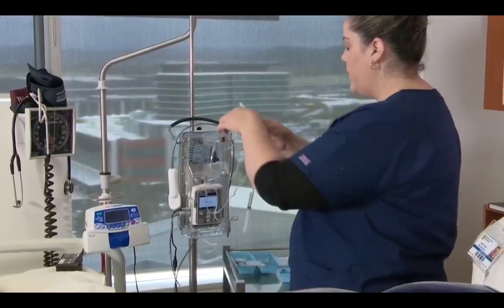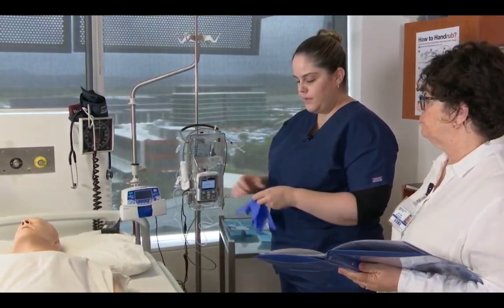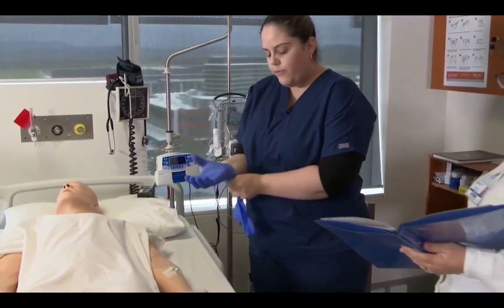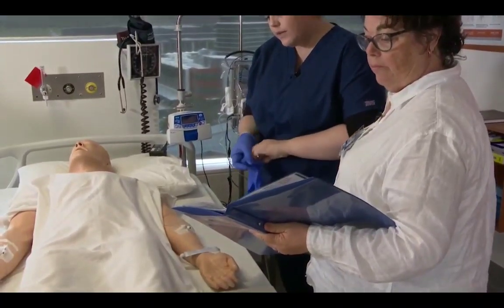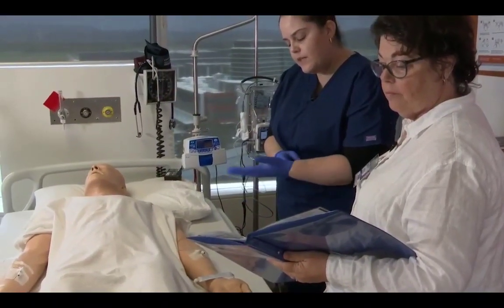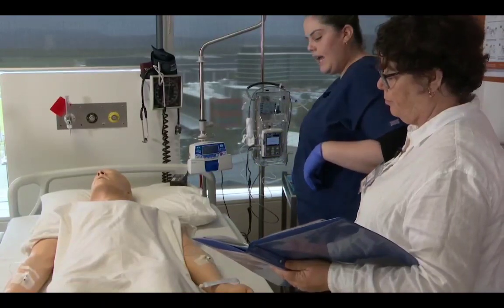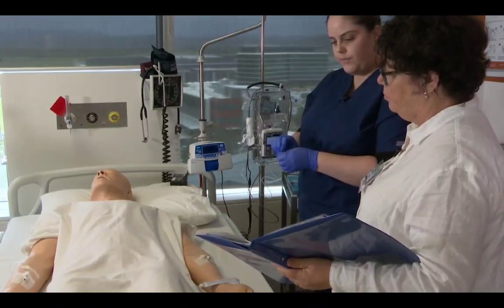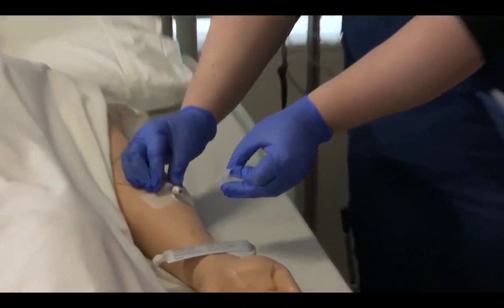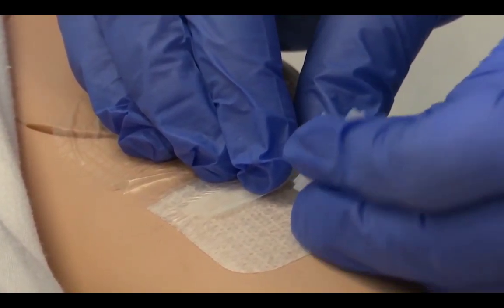So I'm going to place that just there for the moment. I'm going to put on my gloves. John, can I just get you to confirm one more time your full name and your date of birth for me? This is John Bryant, the 13th of the 3rd, 48. Yep, that's perfect. MRN is 2017-05. And confirming that you don't have any allergies that you're aware of. You do not. Okay. So taking my Alco swab, coming to my cannula, swabbing that for 30 seconds.